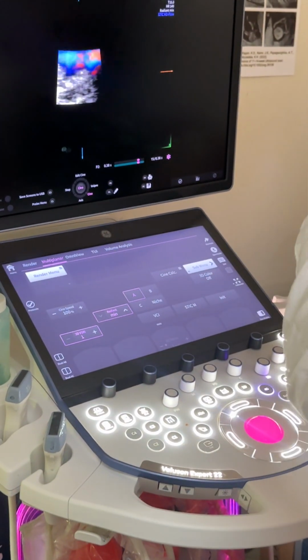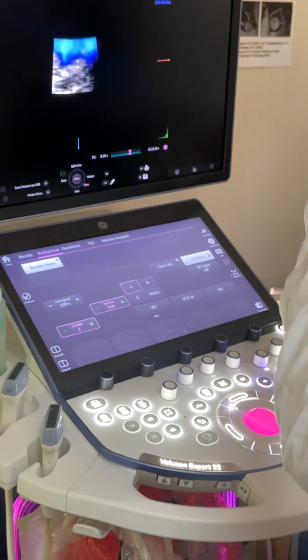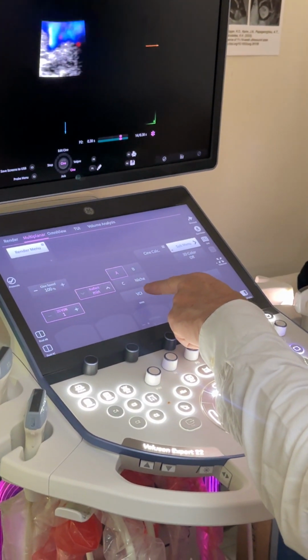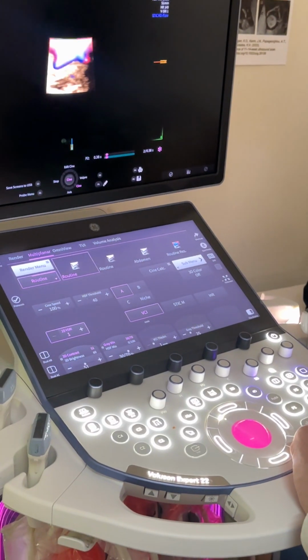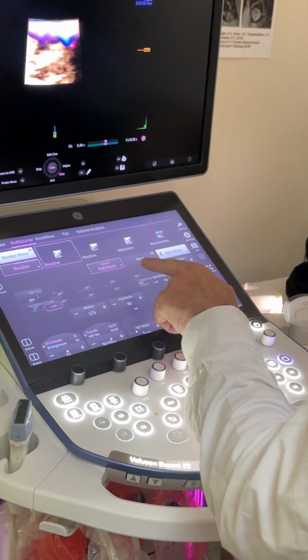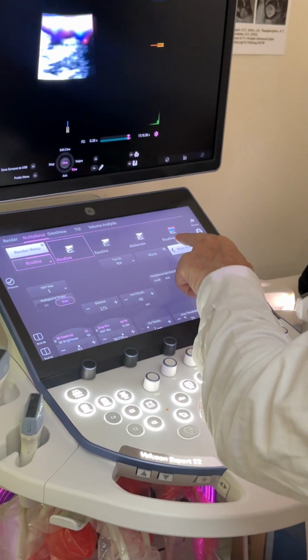Because it may be going in a direction, in an anterior posterior direction that's not straight, like many arteries in the body, you then use VCI. And then with VCI, I want to change the background. Just bear with me. I don't like sepia, so I'm just going to go to ice. So come back to the main.